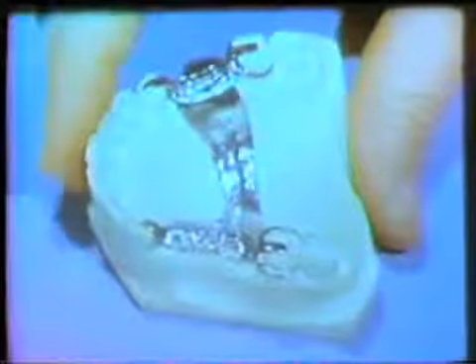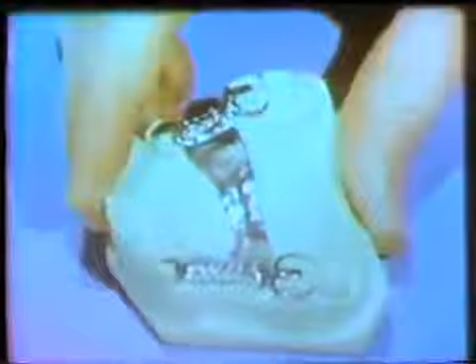The most obvious advantage to this application of the rotational path concept is the elimination of buccal or labial clasps on the anterior abutments, resulting in an aesthetically pleasing as well as functional prosthesis. The other advantages described previously are also valid in this situation.